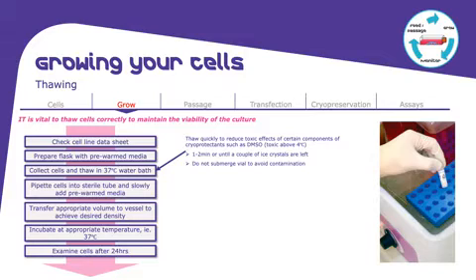degrees. The reason for that is, as I hope you remember, one of the components in the cryopreservation medium is DMSO, and DMSO is very toxic. Also, if you're working with stem cells, it also leads to differentiation. So it is very important to thaw the cells very fast in the water bath, and try not to use your hand or an incubator. Water baths, doing it fast and easy.